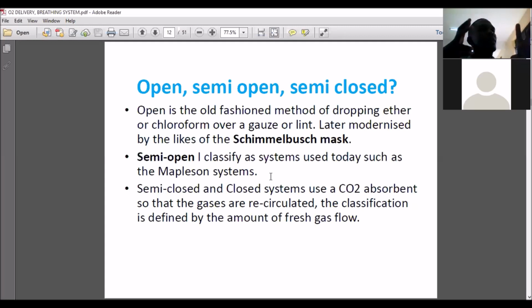The closed can be like the astronauts. The oxygen is all the same. Because you're continuously receiving the same oxygen in the closed system, I am not adding any oxygen to your system. It's once and for all. Are we together now on that?